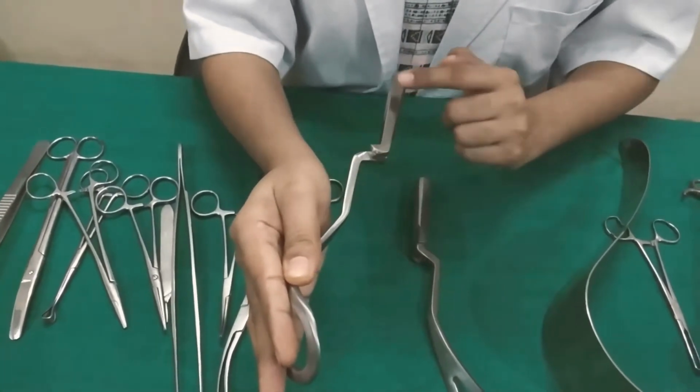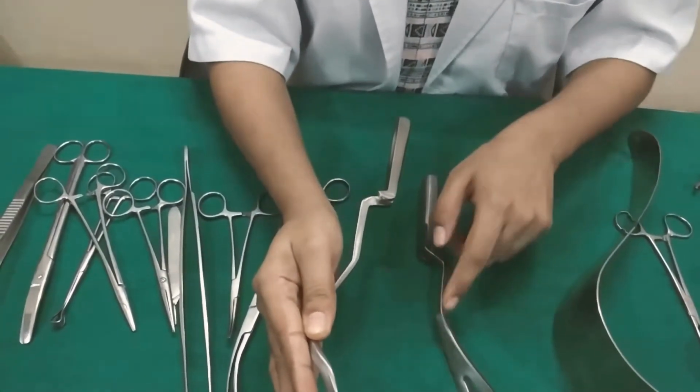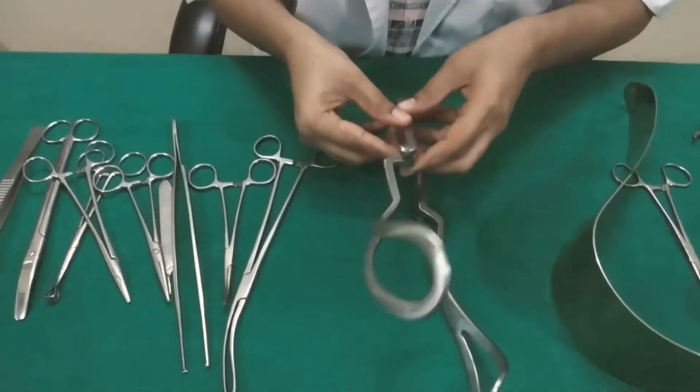In the same manner we apply the right blade. Then locking of the blades has to be done.